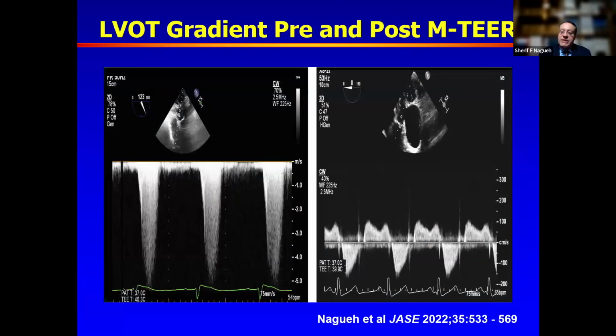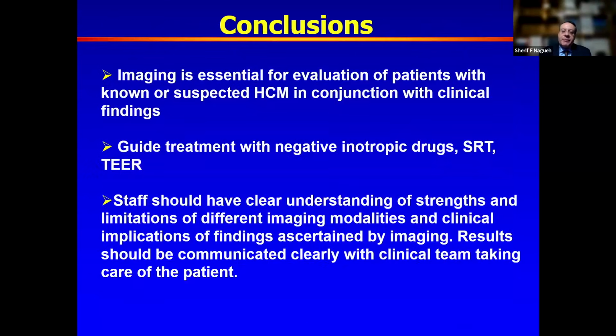What happens to the obstruction signal? The obstruction is happening because of excessive mobility of the mitral valve. The clip restricts that mobility, and you have a velocity that is almost 5 meters per second aligned within the transgastric view. This is before the clip is deployed. After the clip is deployed, we see early peaking, no obstruction. So it resulted in effective treatment of obstruction. Of course, all the proper measurements needed to make sure that a patient is not left with mitral stenosis should be evaluated in the transesophageal echo before the procedure is obtained.